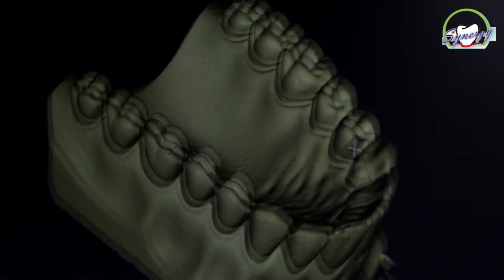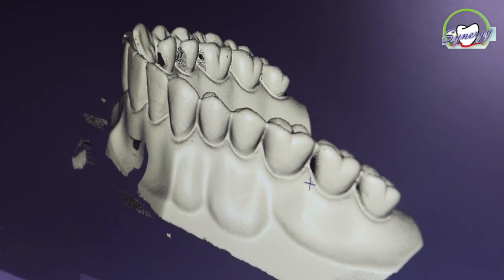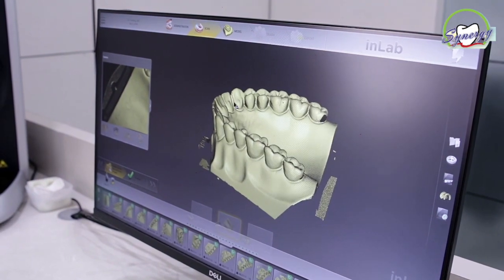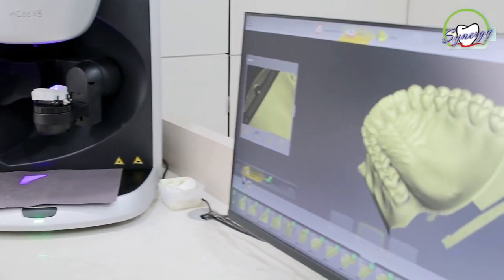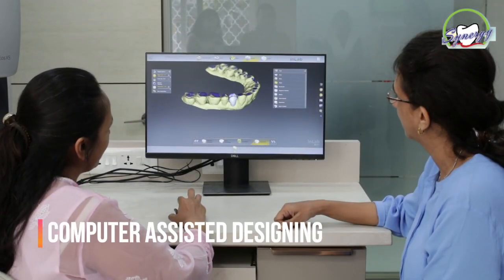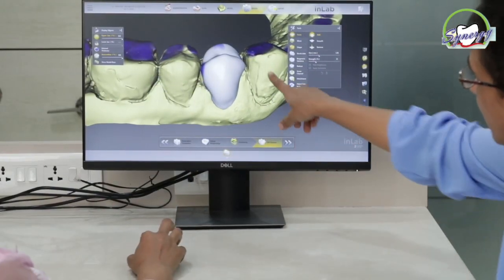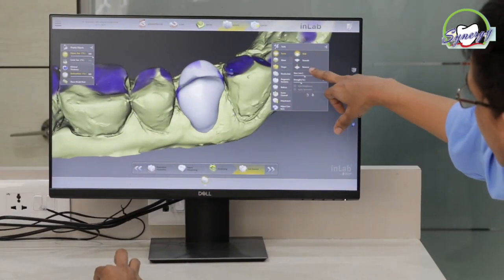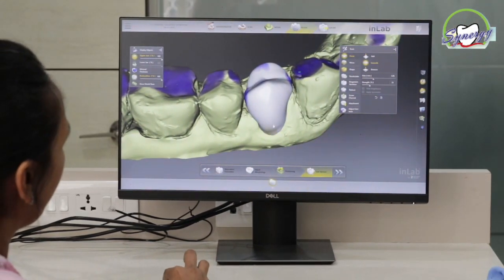This results in digital models with just a few clicks. Once the digital models are created, the prosthesis can then be designed using the In-Lab design software. The software allows you to virtually design the prosthesis on a computer screen. To check the accuracy, we can enlarge the restoration and check in detail the margin, fit, contact, shape, etc. Digital designing therefore results in superior quality restorations compared to manual laboratory steps.